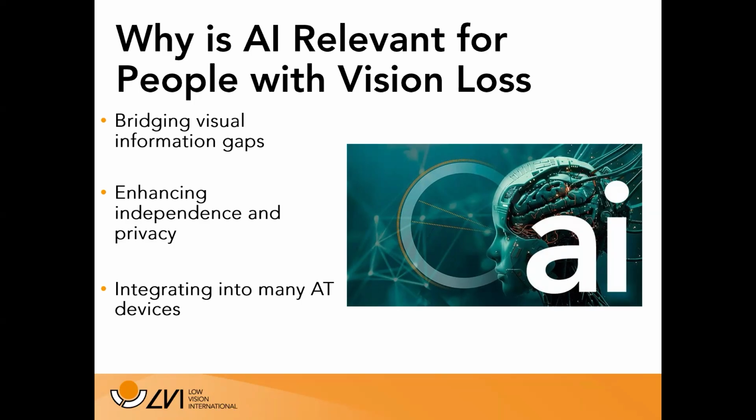So, with this individual, with a device that could recognize a face and a device that could, with just a simple gesture, announce the time quietly to him, he could perform the same types of tasks as a sighted piano teacher might do simultaneously to keep that studio running. So, that's just one example. AI offers a level of independence that is a very, very high value for people with vision loss.